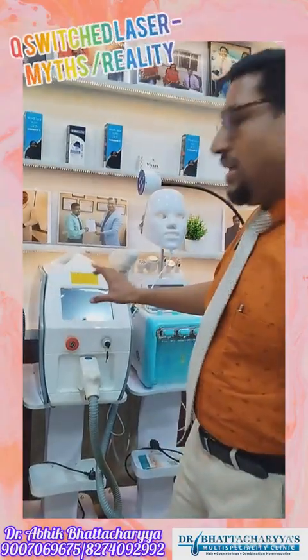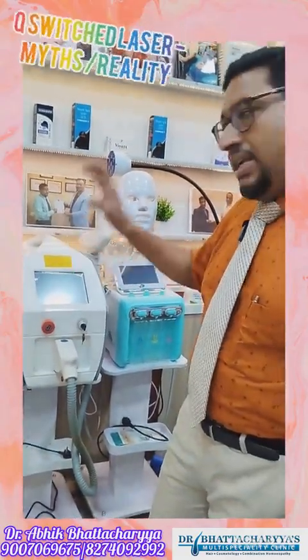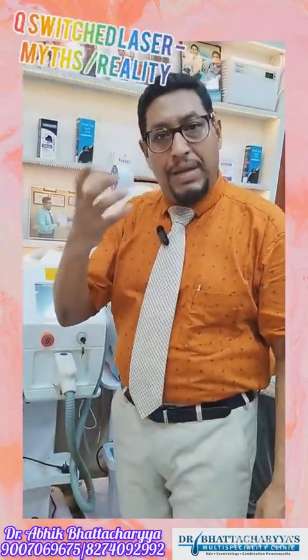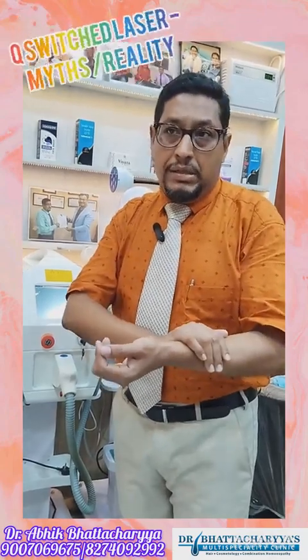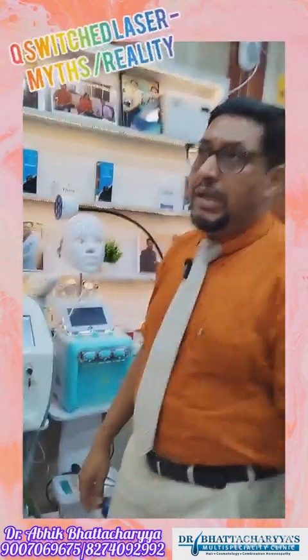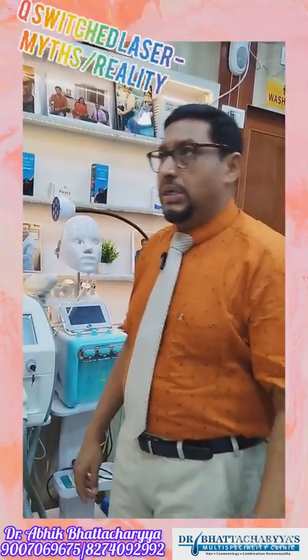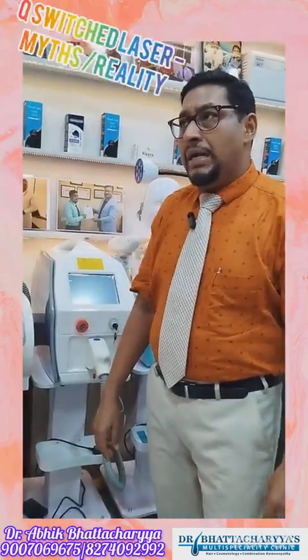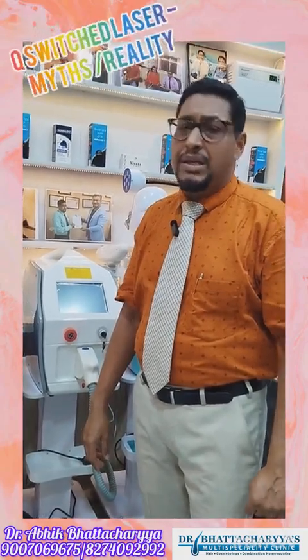The Q-Switch laser is a very good laser. It helps in pigment deletion. It helps to reduce blemishes and pigments, and helps with acne scars. It helps to remove your tattoos. But I really think tattoo removal is a misnomer, or rather eyewash. I don't think 100% tattoo removal is possible.